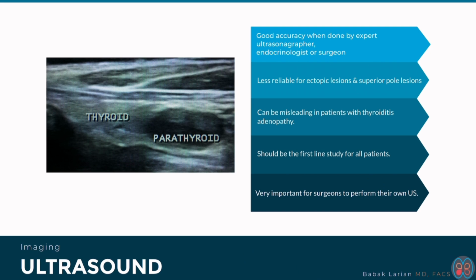Ultrasound. I do my ultrasounds myself on all my patients, even if they've had a previous ultrasound. There are times where the person has an ultrasound, they don't find it because the ultrasonographer was more interested in thyroid disease than parathyroid. And they come to me and I'll do an ultrasound and I find it. And this is an example of one. Let me show you again.